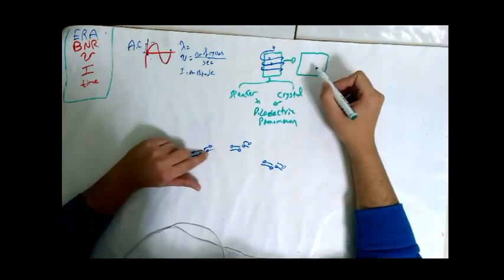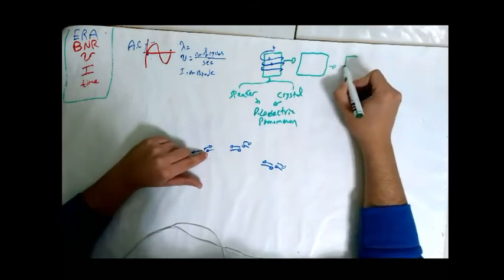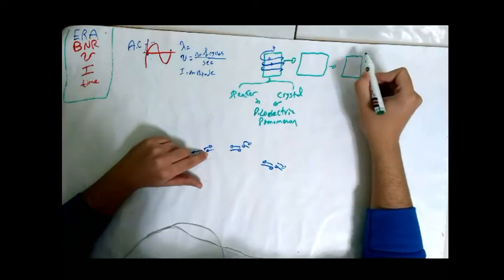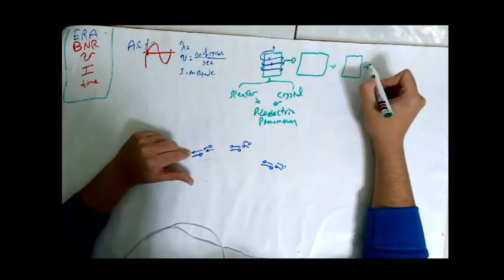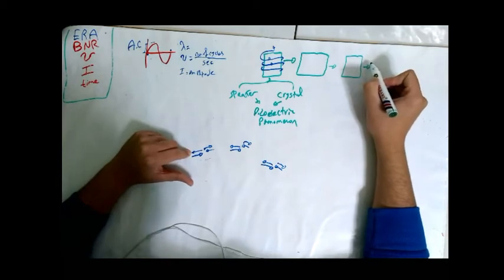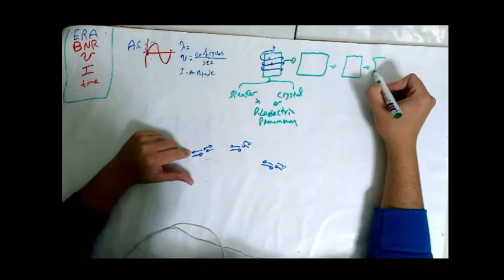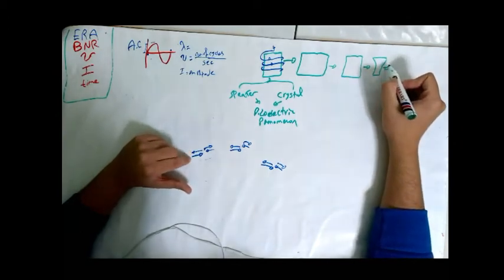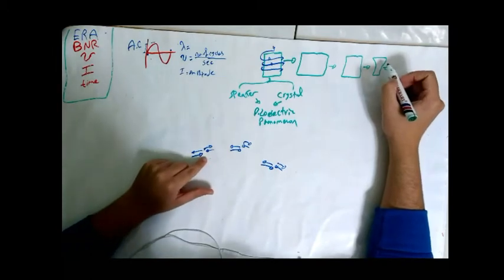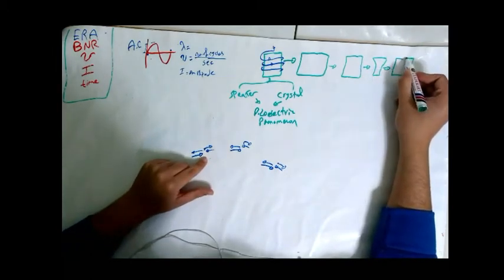When the electrons return back to the original position, the material also returns back to its original position. When the electrons pass the original position backward, the material will shrink. When the electrons return back again to the normal position, the material also will return to the normal position.